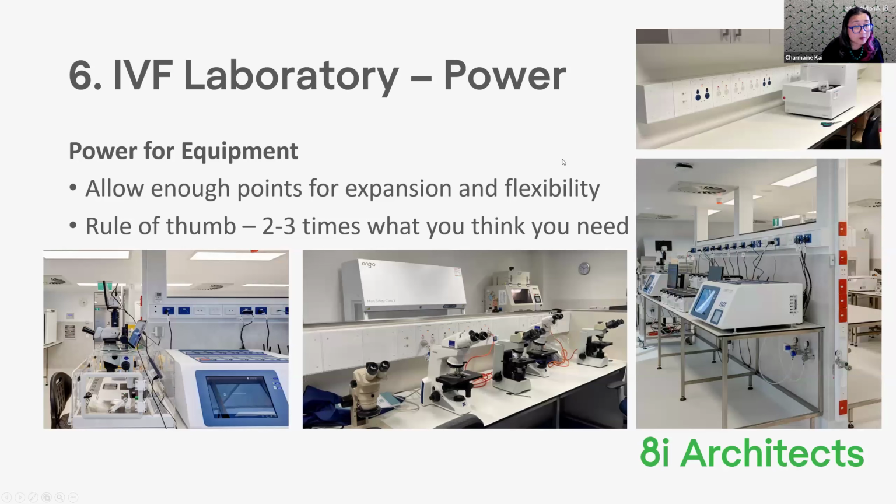So within the lab, power for the equipment. Allow enough points for flexibility and expansion. Here are a few different labs I've done over the years in terms of power and how we look at putting in PowerPoints. A lot of times I'll use what are called ducted PowerPoints.